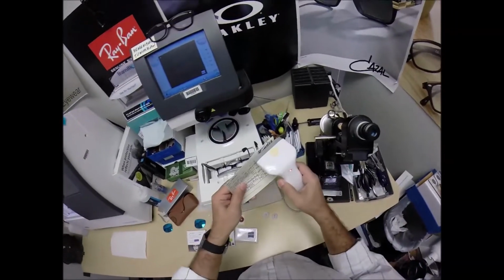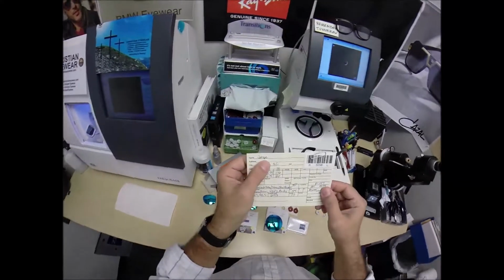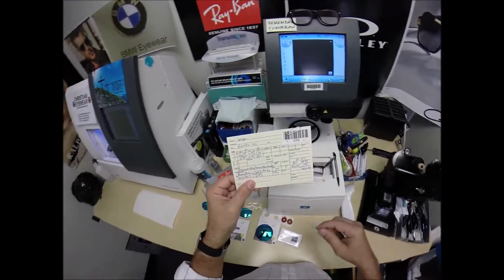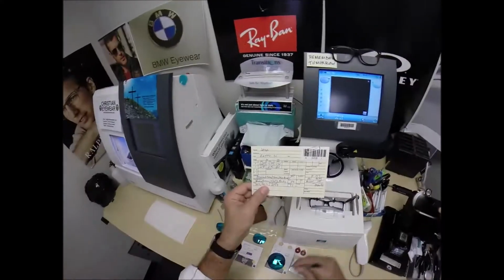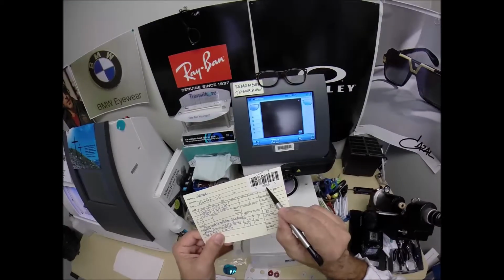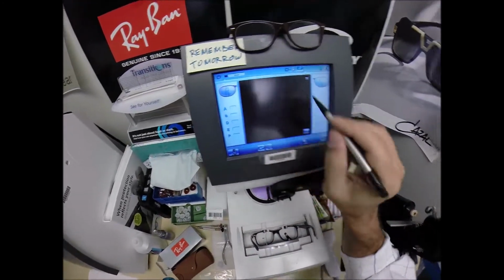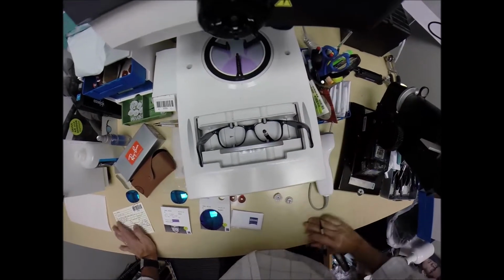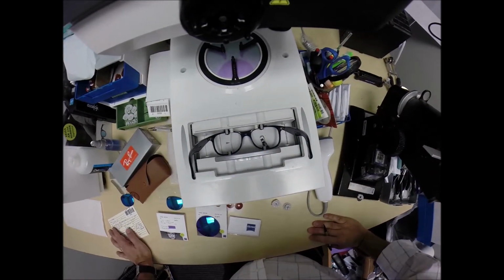Now, this is the second pair of glasses that Jorge has gotten from me. He got a pair from me one or maybe actually two years ago, so he's coming back for more. I do appreciate your return business. I'm going to hit this. You are secret agent 3058. I'm going to hit the start button. Little stylus is going to pop up, go around, trace the inside bevel of the right side of the frame before doing the same thing on the left.